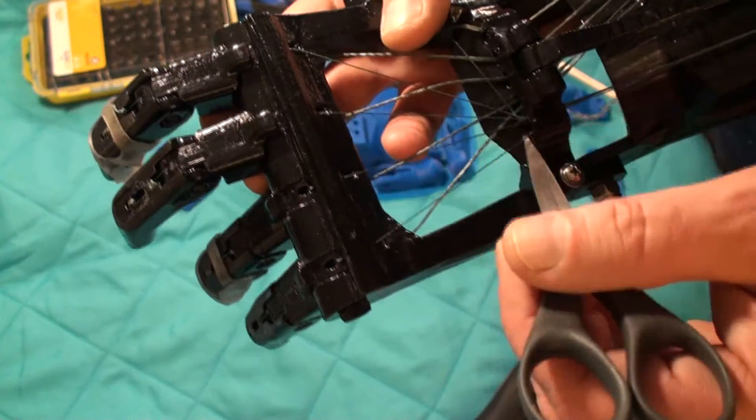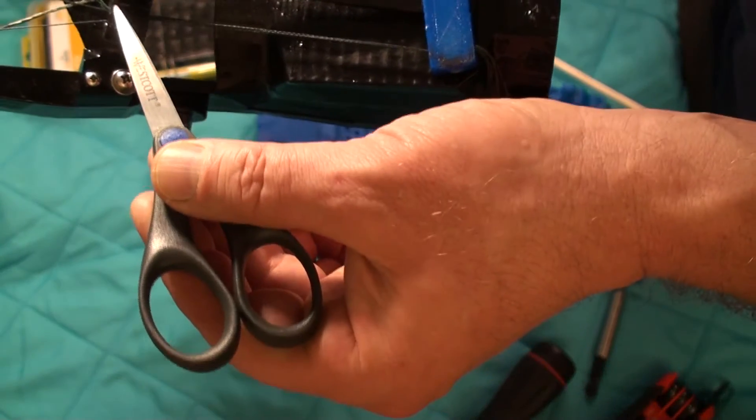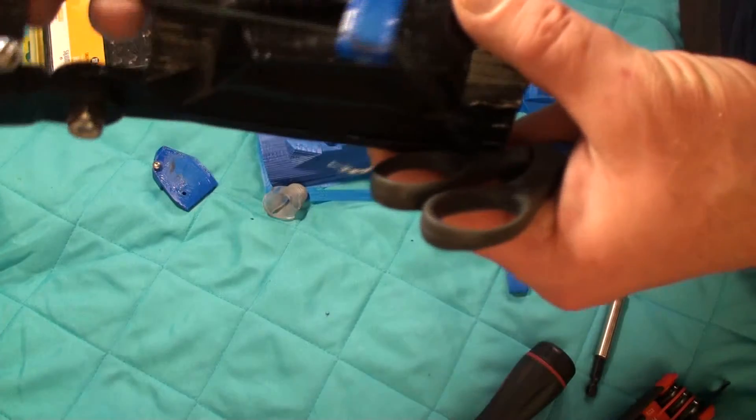I've got them all coming over to the end here, which I think is going to make the pivot more effective — if I have them running through there, that's what I decided.